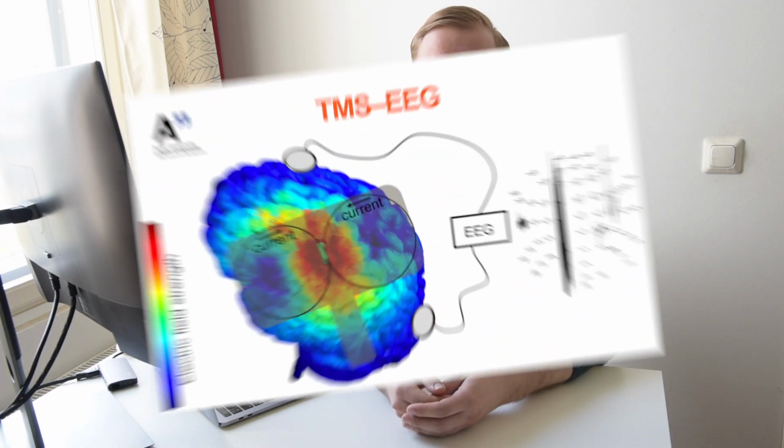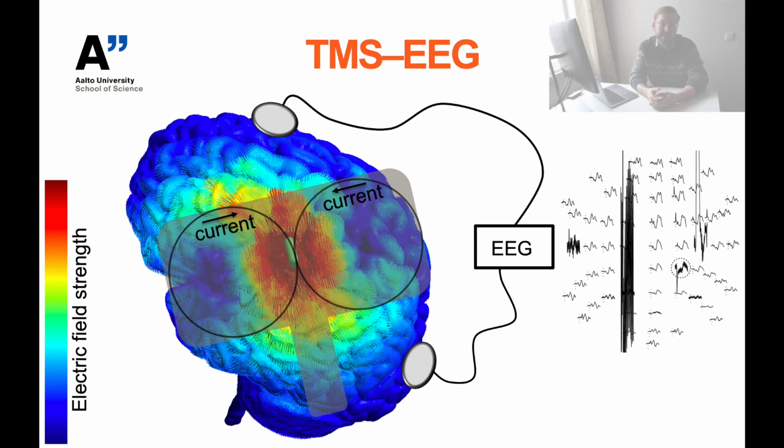In addition, I will go through some theoretical foundations of these methods to help you understand what they are made for and how they work. So I will give you a super quick introduction to combined transcranial magnetic stimulation and electroencephalography, because I'm sure that for the vast majority of you, it is a very familiar method.